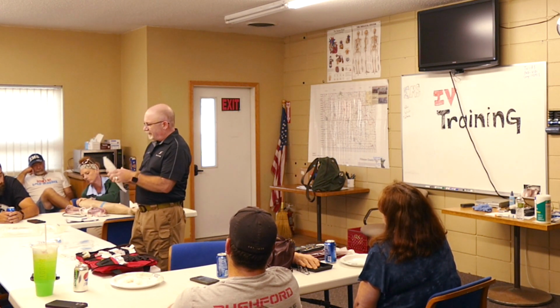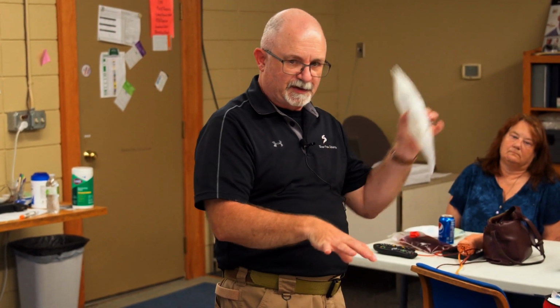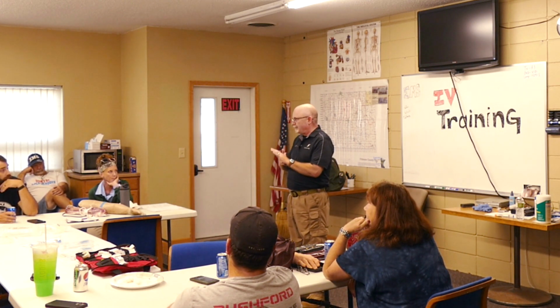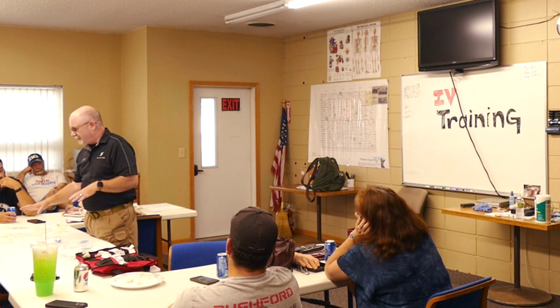The other solution you're going to have in your truck, and are you planning on keeping this separate from the rest of your solution? So this would be more in the IV grab bag, we just have the saline. Okay. Perfect. The D10 is just kept in the truck. Okay. And that'll be near the rest of your diabetic testing. So your D10 is a totally different thing.